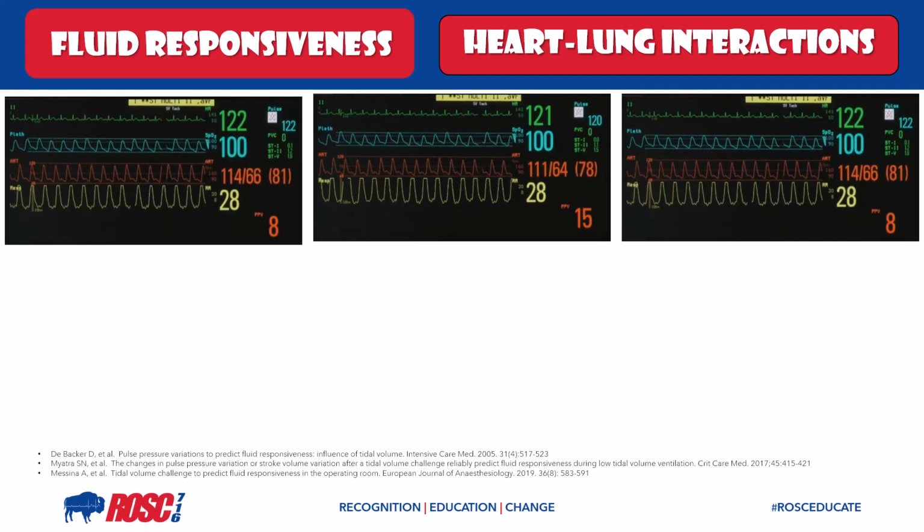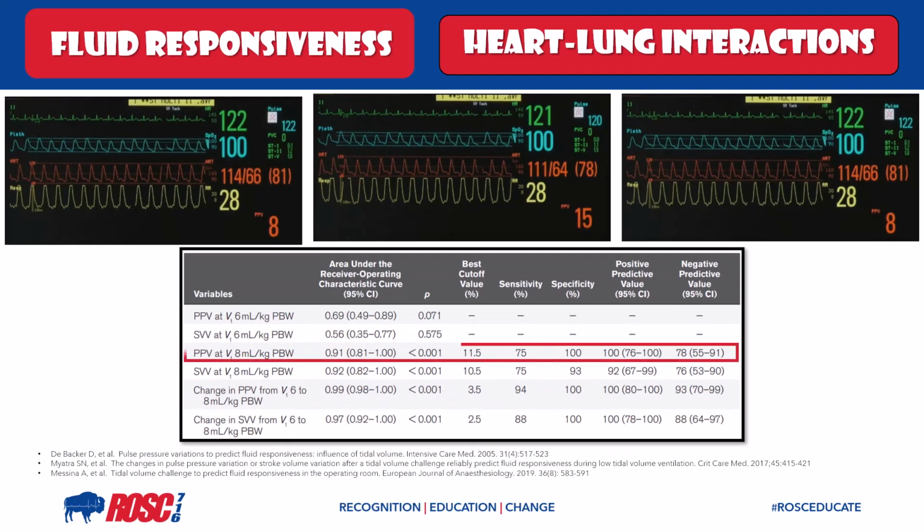How about the accuracy of this test? So first you can see if the pulse pressure variation on 8 mLs per kilo of predicted body weight tidal volume hits a threshold of approximately 12% or higher, you have a sensitivity of 75% and a positive predictive value of 100% to predict fluid responsiveness, so quite accurate. However, we can do better.